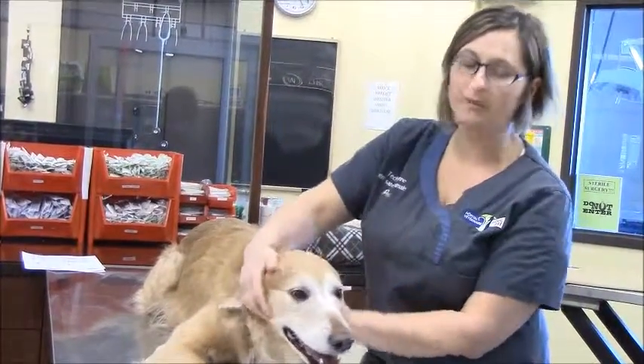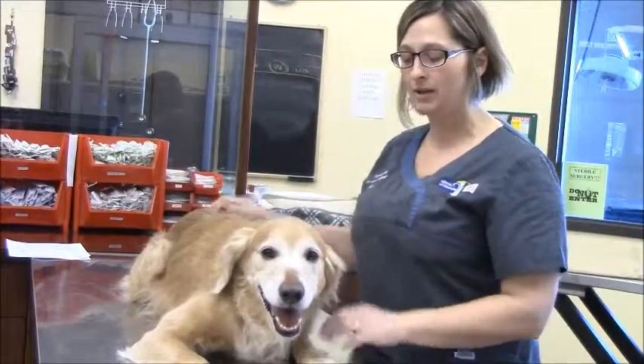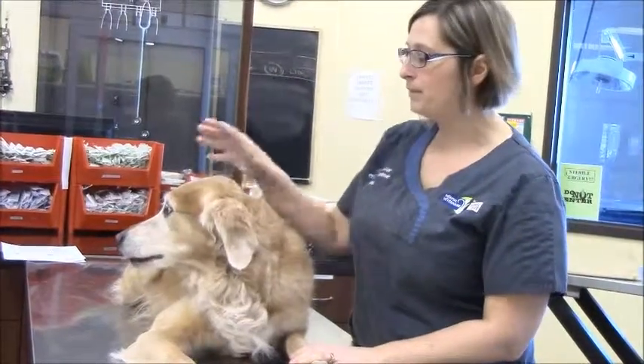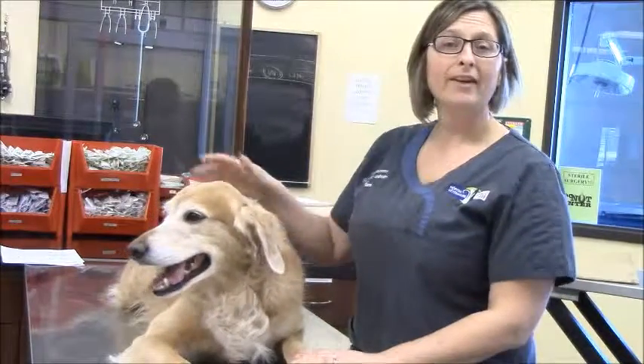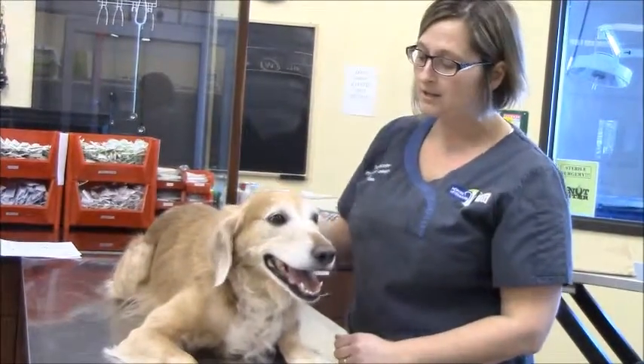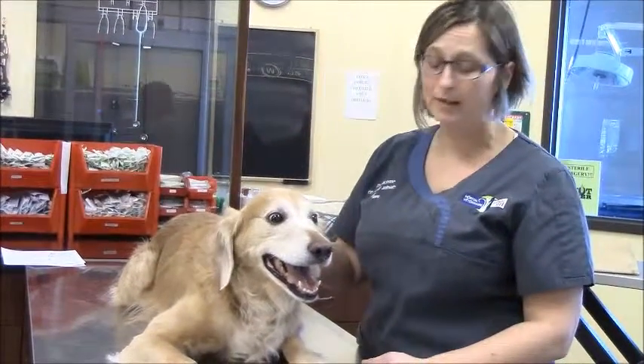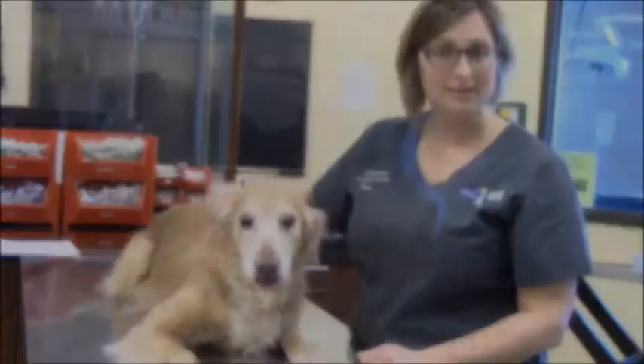So what we're going to start with is having the doctor come in. He's going to do a pre-exam on Ruby to make sure everything is okay. We're going to give a sedative to calm her down and put her back in the kennel to relax. After that, we're going to show you step by step our process for the dental cleaning, because we are aware that anesthesia is a fear for most people, so we want to show you all the precautions that we take to minimize the risks of it.